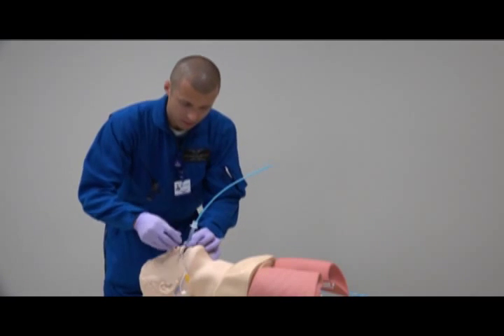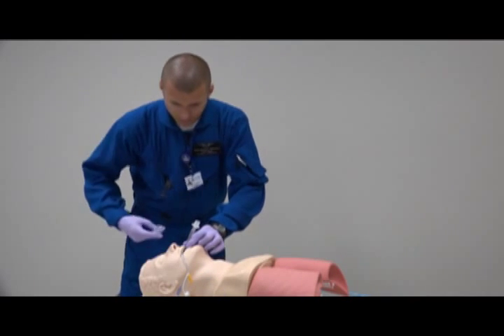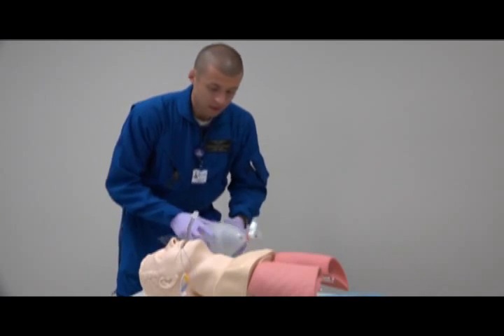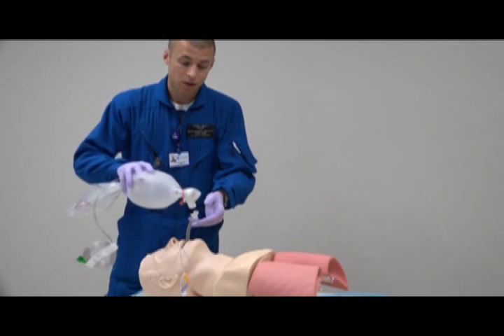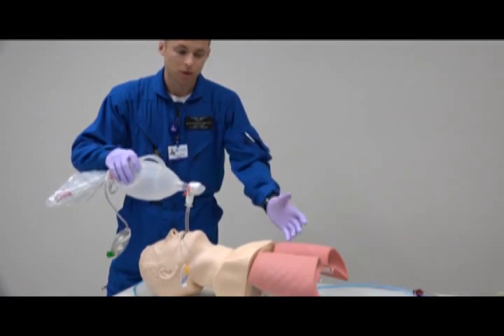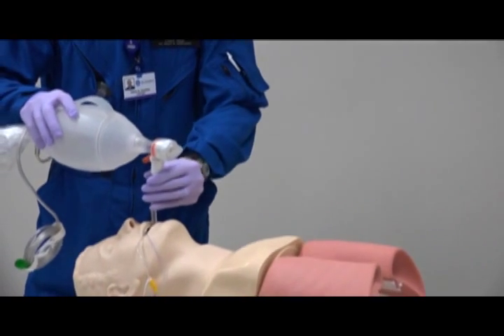Once I've got to the proper depth, inflate the cuff, and then always make sure you use your secondary airway confirmation with end-tidal capnometry. Simply bag the patient — we have good lung sounds — always make sure you listen and secure the tube as always.